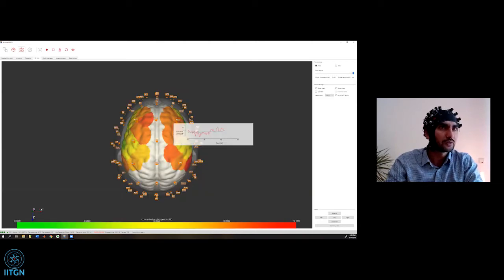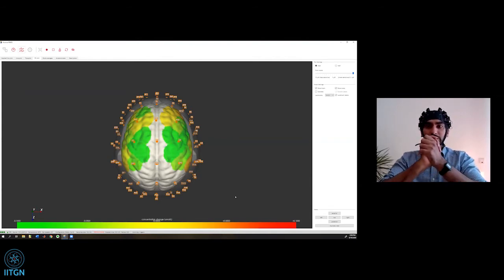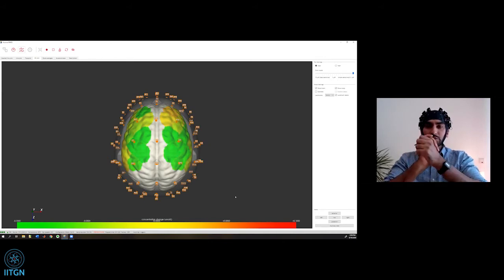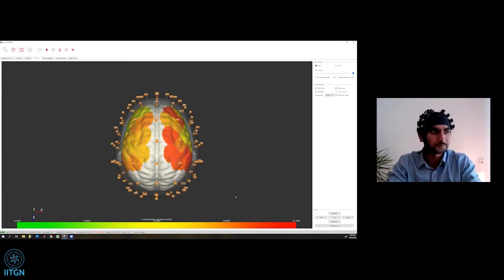Just to give you a brief idea of how an activation will look, I sit silently and then press my hands together. And then I let go. And press my hands again. See, there's a nice real-time correspondence between what I'm doing right now and what we can already see. And this is a single subject, single trial. You would want to do more subjects, more trials. But Thomas will talk a little bit more about how the hemodynamic response develops and what it looks like.